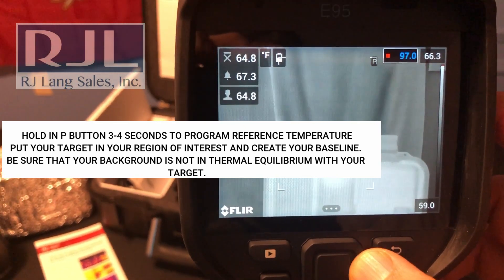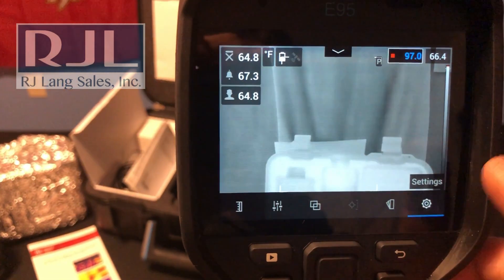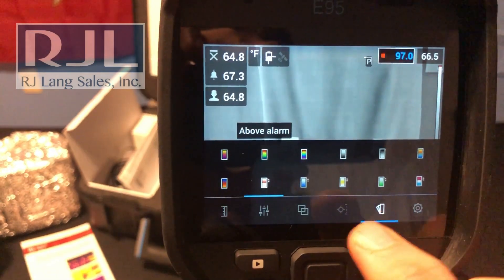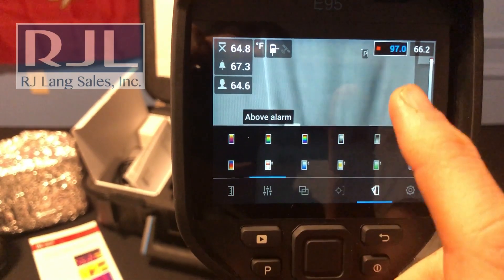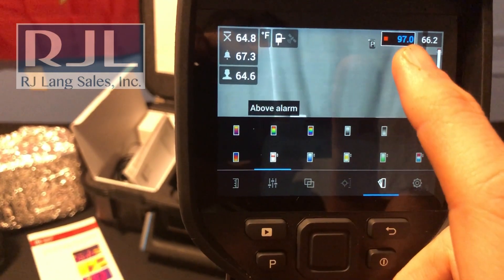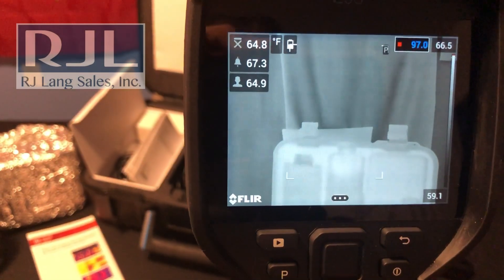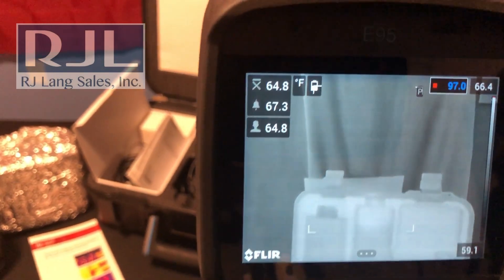What I can also do is set up the isotherm — something that I like — so an above alarm, and I put it at 97 degrees, so anything above 97 degrees will trigger it.